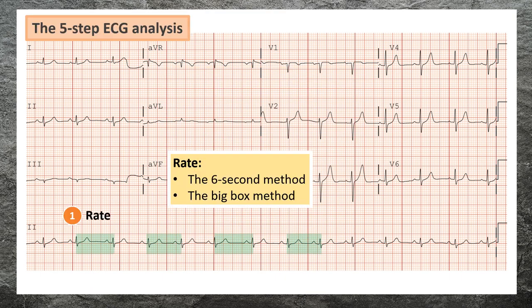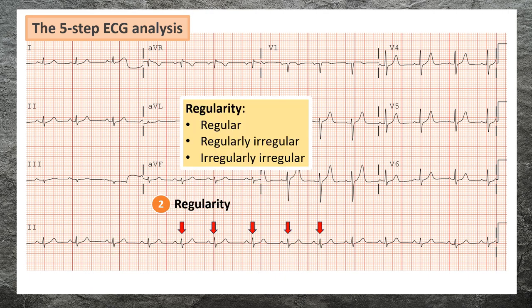Step one: determine the rate of the rhythm. Method one is the six-second method — count the number of R waves on the six-second strip and multiply by ten. Method two is the big box method — divide 300 by the number of big boxes between two consecutive R waves. The big box method is only used for regular rhythms.